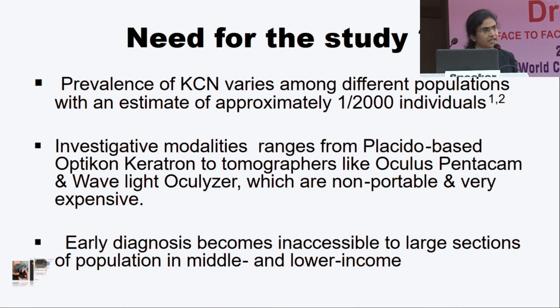So the need of the study is India. Actually, when you see, the keratoconic population is extremely high because of the thin and steep corneas as well as the irritation and eye rubbing. Investigation modalities used for screening, usually the Placido-based ones like Keratron to that of Pentacam, are all non-portable and very expensive. So early diagnosis with respect to these machines actually becomes inaccessible to the majority of middle and lower income.